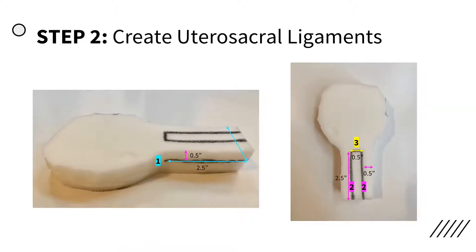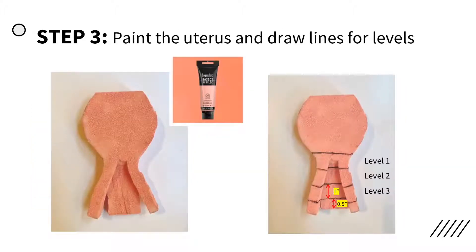Next, create the utero-sacral ligaments. For better visualization, the incisions are highlighted using various colored lines in the photo, and they can also be seen on the provided PDF template. Paint the uterus with Liquitex Light Portrait Pink paint thinned out with water and let it dry. Then draw four horizontal lines along the posterior side of the uterus and utero-sacral ligaments with a black permanent marker. The first line should be half an inch from the base of the cervix, and each subsequent line should be about one inch apart, moving proximally. These lines help divide the model into three levels of difficulty during the simulation, with level one being the easiest and level three being the most challenging to dissect.